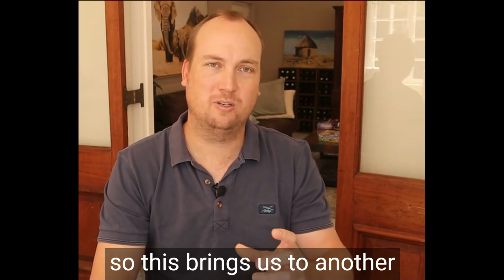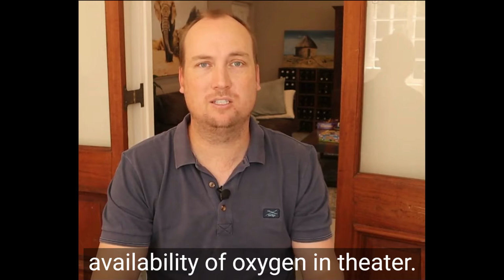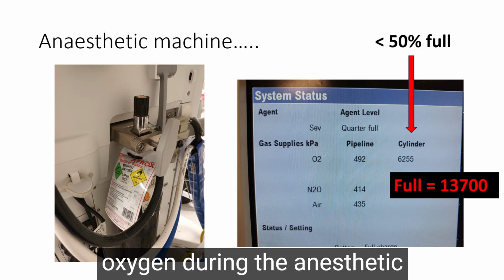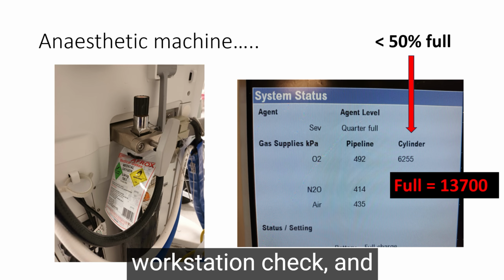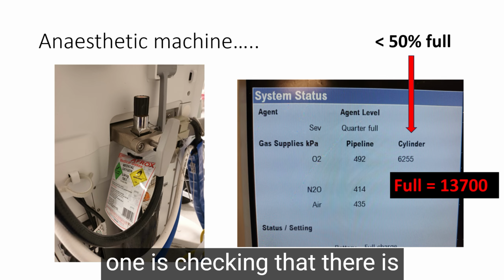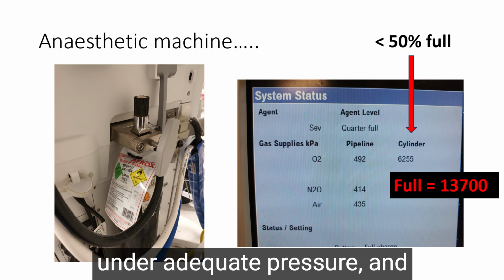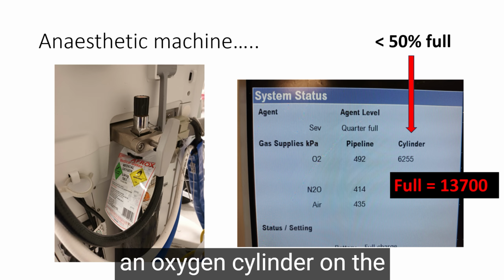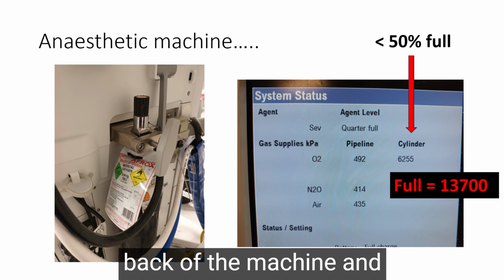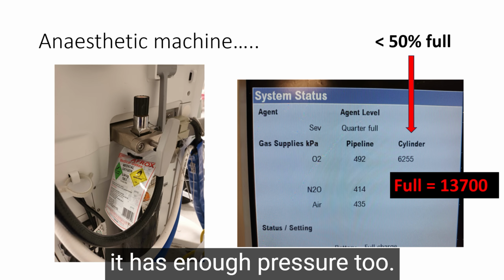So this brings us to another really important safety point, and that is checking the availability of oxygen in theatre. We check the availability of oxygen during the anesthetic workstation check, and there are two steps to that. One is checking that there is piped oxygen to the machine under adequate pressure, and then checking that there's an oxygen cylinder on the back of the machine and that the cylinder is full and has enough pressure too.